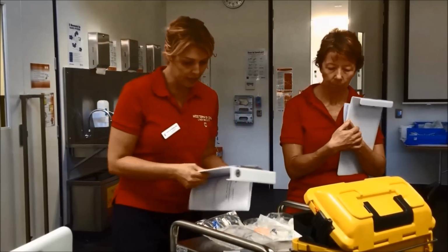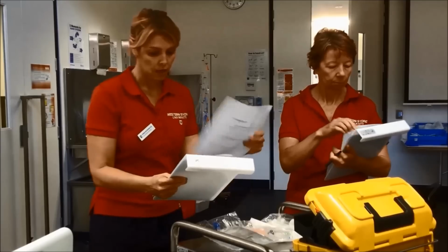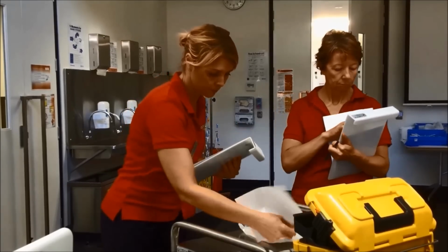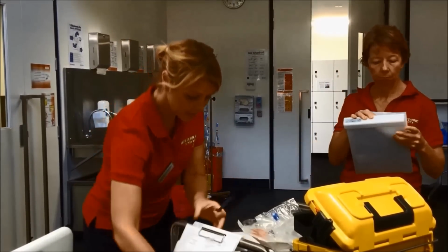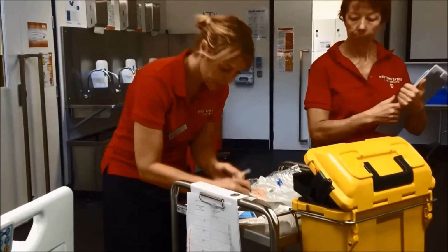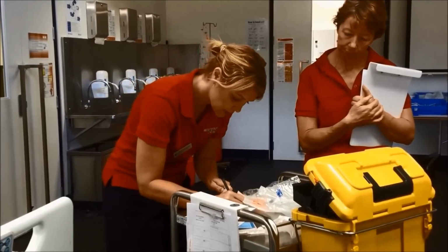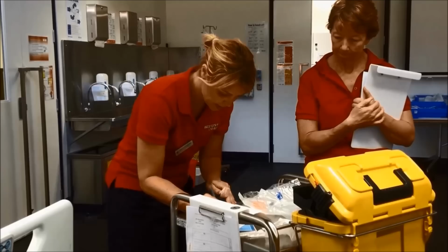Okie dokie. So now I'm going to do my maths calculations. Okay, so I'm going to give, the order is for 80 milligrams. Strength required over strength in stock, which is 80 milligrams. 2 mils equals 2 mils I'm going to draw up, or 1 vial.